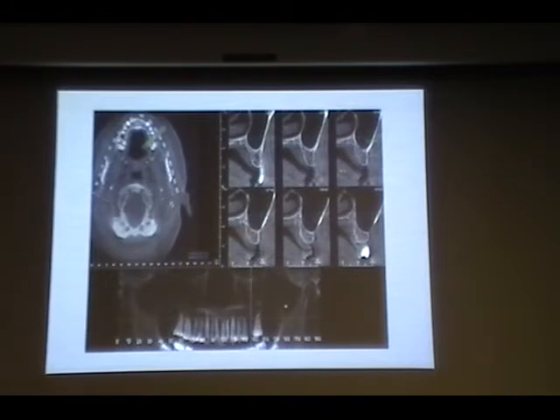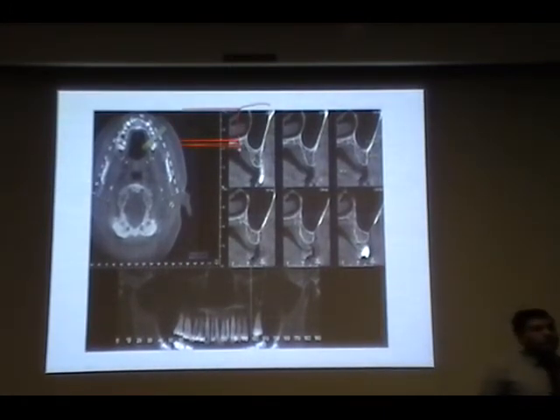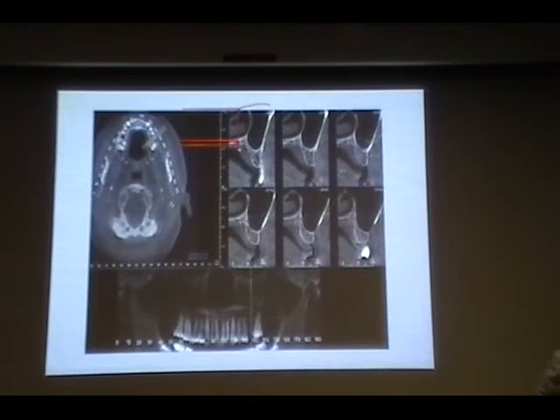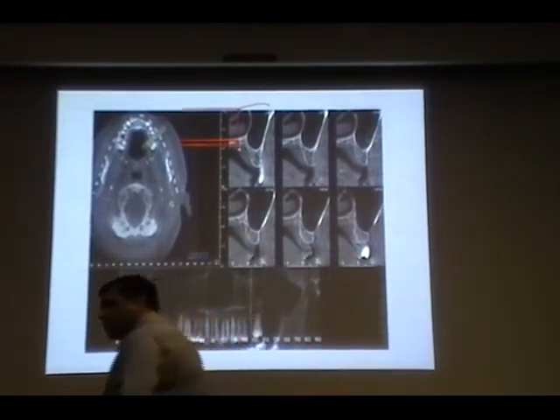And then when I looked at this one, here is a very good example, Madeline, like you asked, why do we need to see different slices? If you look at that particular first slice, you can see intact walls of the maxillary sinus. Whereas when you go down, you can see there is a breach, missing, right? So if there is communication between the oral cavity and the antrum, we would call it an oral antral fistula.